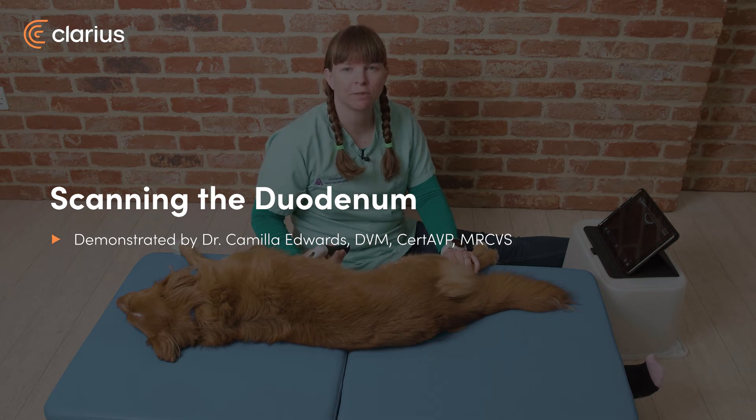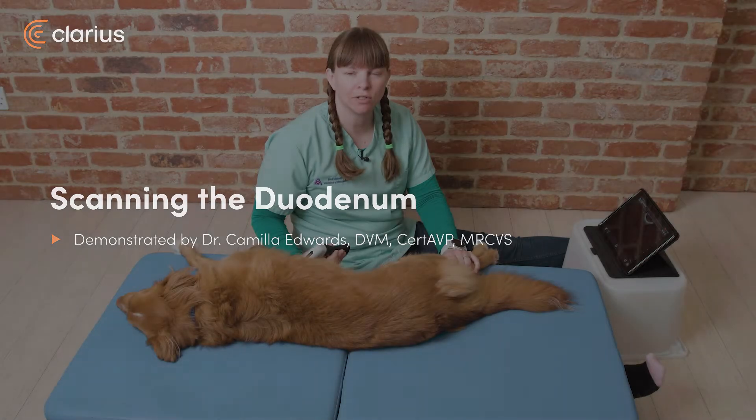Hi, I'm Dr. Camilla Edwards from First Opinion Veterinary Ultrasound, and today we'll be looking at how to scan the duodenum in a dog.